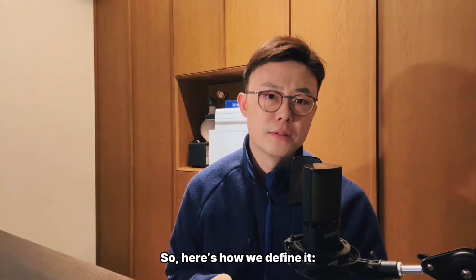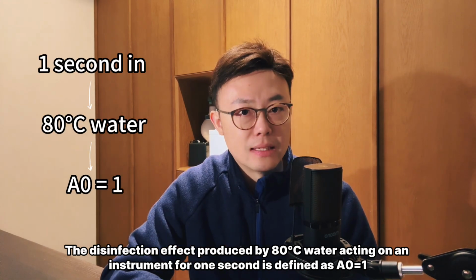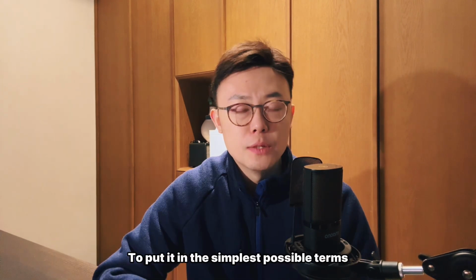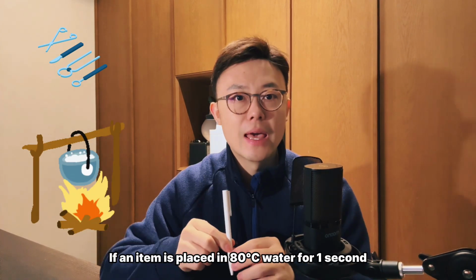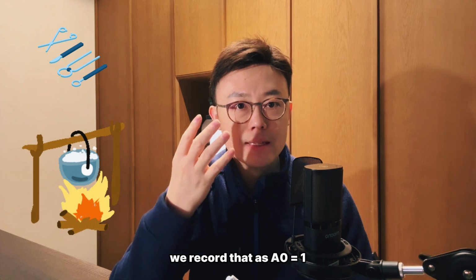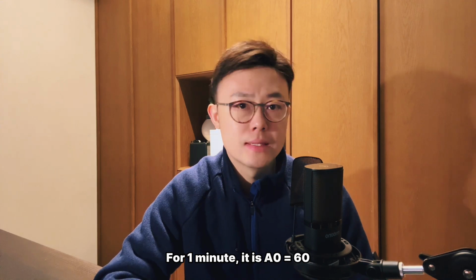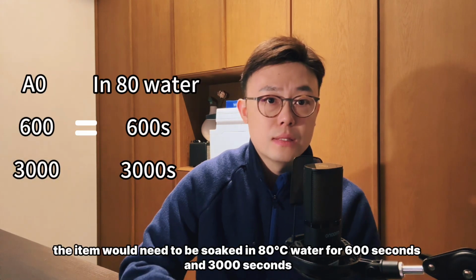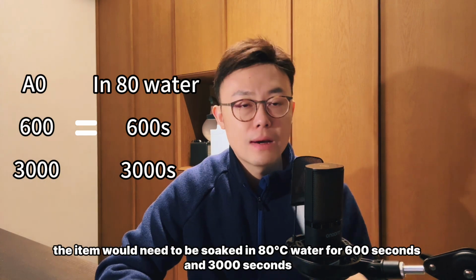So here's how we define it. The disinfection effect produced by 80 degrees Celsius water acting on an instrument for 1 second is defined as A0 of 1. To put it in the simplest possible terms, if an item is placed in 80 degrees Celsius water for 1 second, we record that as A0 equals 1. For 2 seconds, it's A0 equals 2. For 1 minute, it's 60. Therefore, low-level and high-level disinfection simply mean that the item would need to be soaked in 80-degree water for 600 seconds or 3000 seconds, respectively.